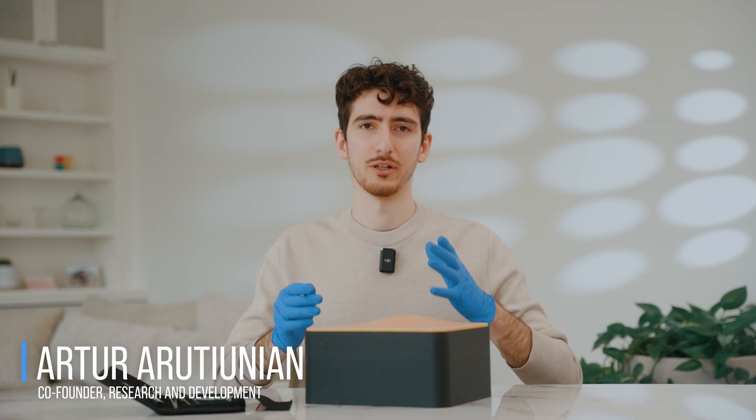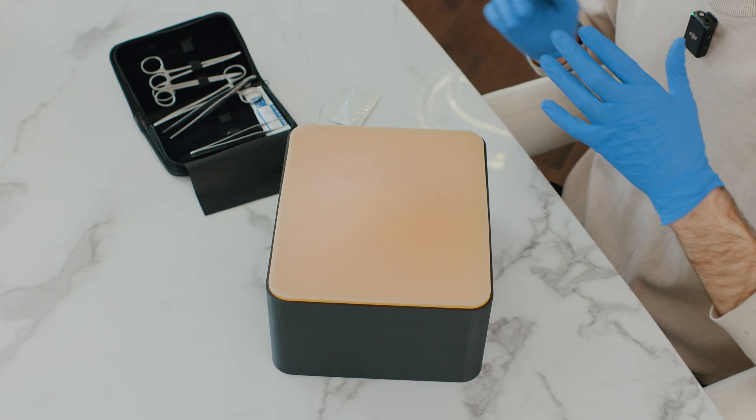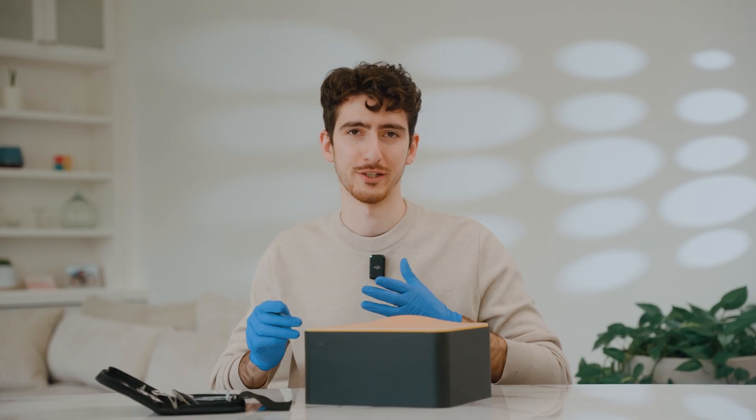This is an advanced abdominal opening and closure simulator that we designed specifically for our client in Europe, and now we're adding it to our product lineup. I think it's a perfect opportunity for us to test it out.